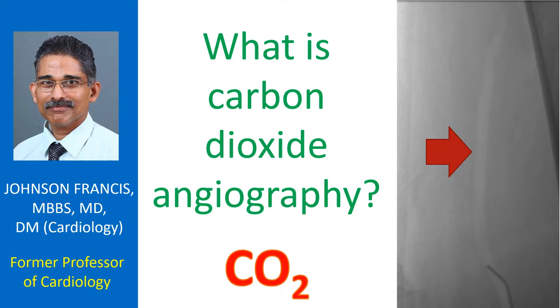Contrast material is needed to show the blood vessel separately from the other body tissue. But usual iodinated contrast medications have a potential risk of affecting kidney function. This is more so in those with already impaired kidney function. It is in this situation that carbon dioxide angiography is usually considered.